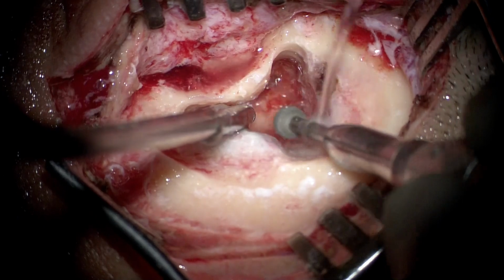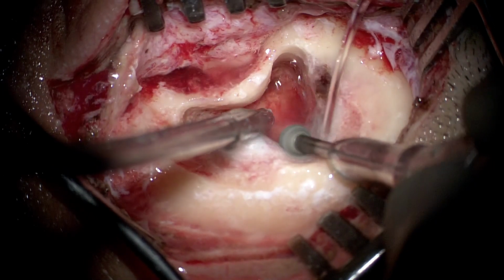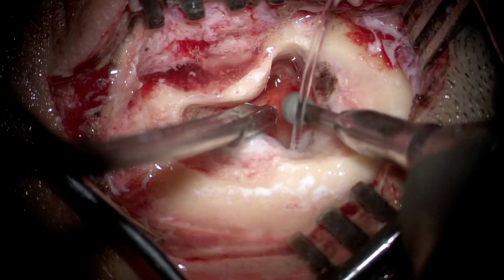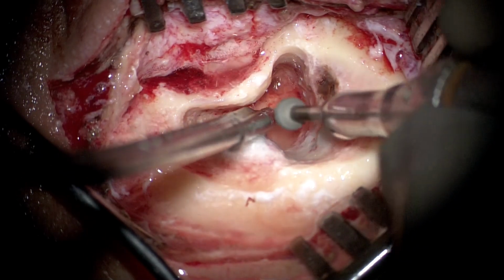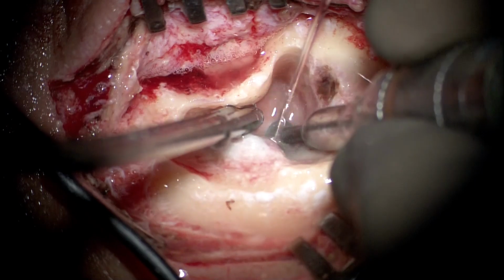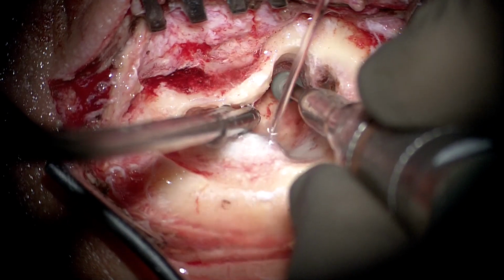Here we can suit the amount of decompression required based on the exposure from time to time. If at a particular moment we feel that the exposure is inadequate and we still need to drill more bone posteriorly to the sinus, then we shall do so. Here, as you see now, we are doing more and more decompression of the sinodural angle.